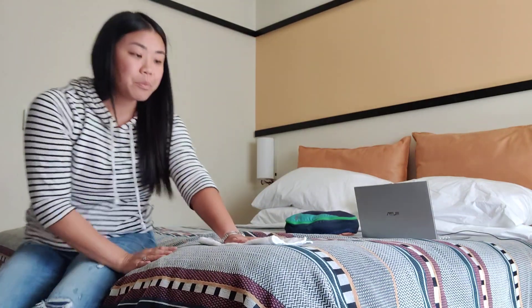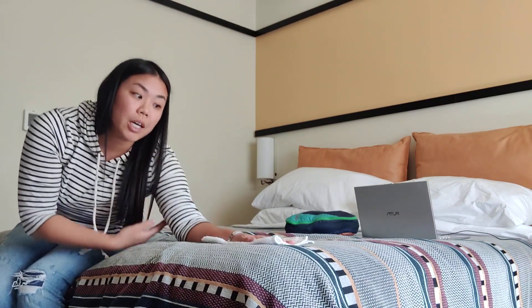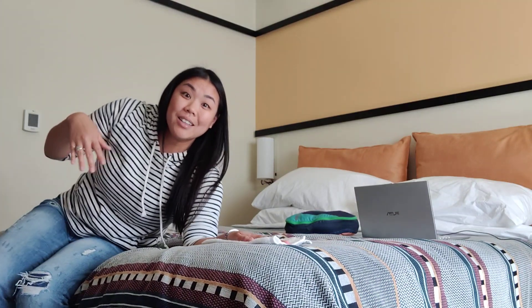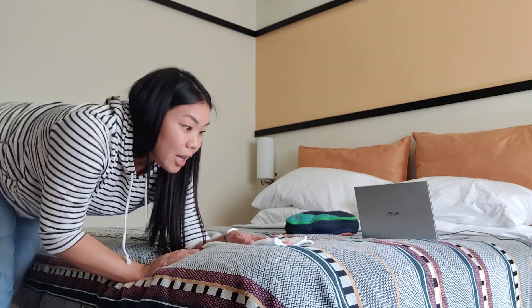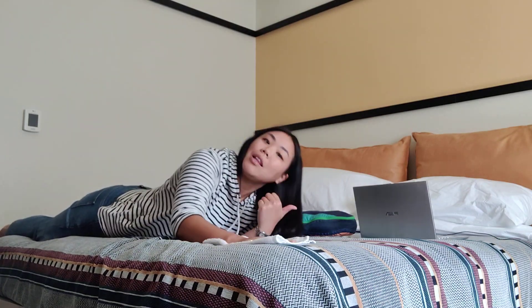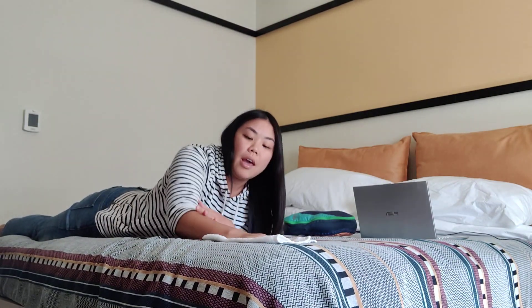With a hand and wrist, it's normally best to have it prone — palms facing down. Have the patient sit and tell them you want the elbow to hit the table. The table is going to go up, so their feet will be dangling. Sometimes it's best to have them lay on the table. If it's the left side, have them lay as close as they can to the right side of the table, and vice versa for the right hand. Make sure there's no jewelry or anything like that.